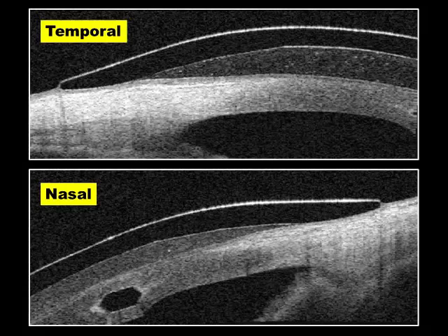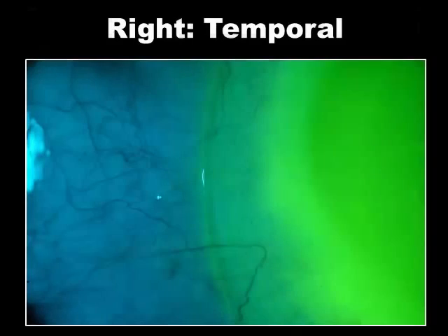Now, is it okay to bear on the limbus? Really, it's not clear in the literature. It's not clear by the experts whether it's okay to touch down on the limbus. So many designers, just to be safe, are saying let's steer clear of the limbal stem cells and just completely vault this area and make sure that we won't have any problems with any kind of stem cell disease or issues.